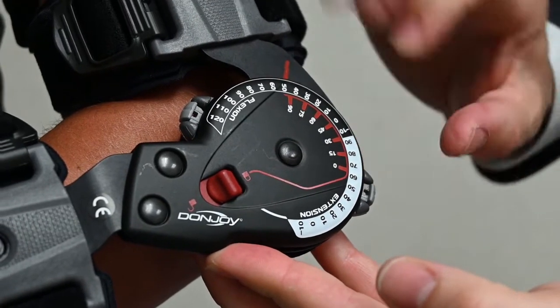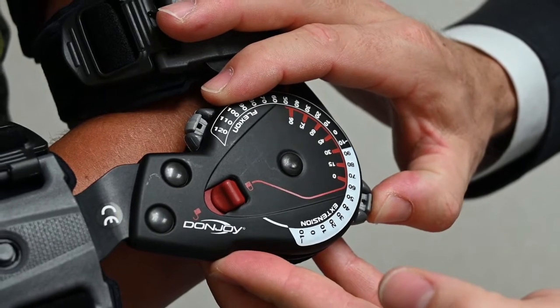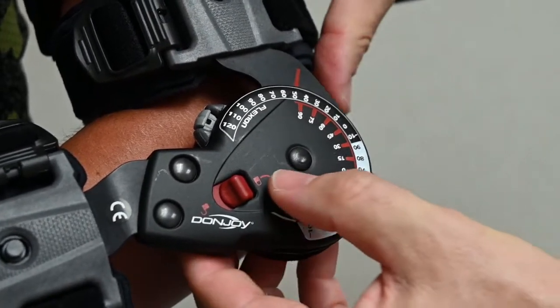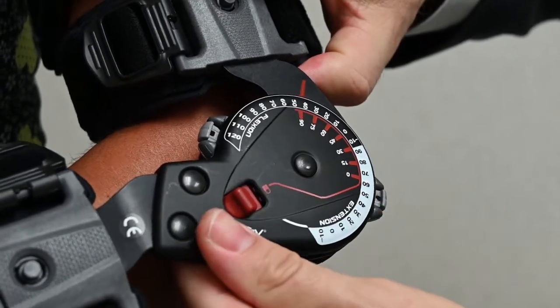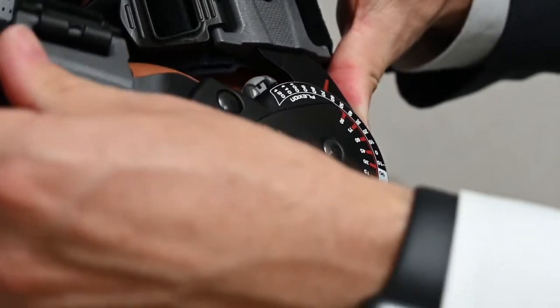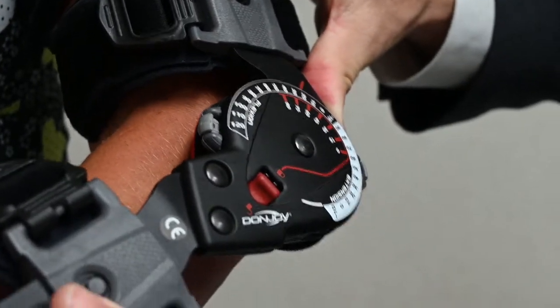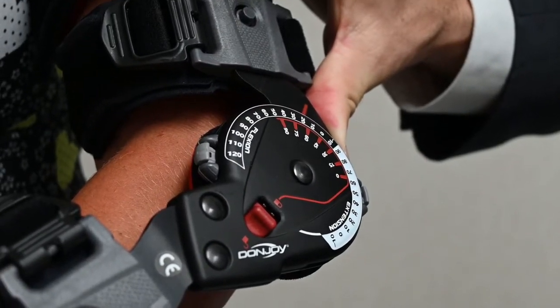This button here is what controls the amount of extension that the brace will allow. So initially, we may have the dial set at only 60 degrees of extension. If I unlock the brace, the brace will only go to 60 degrees and then stop. It will flex all the way up, but it will stop at 60 degrees and will not allow the arm to go any further.